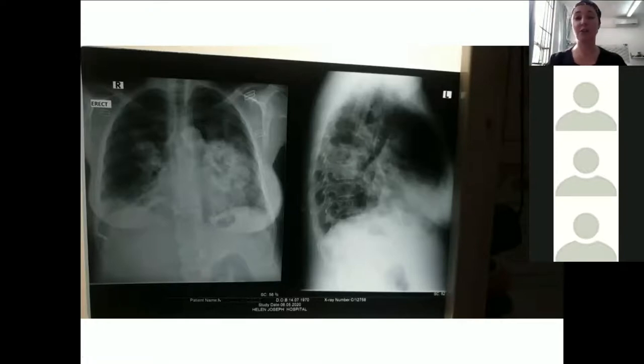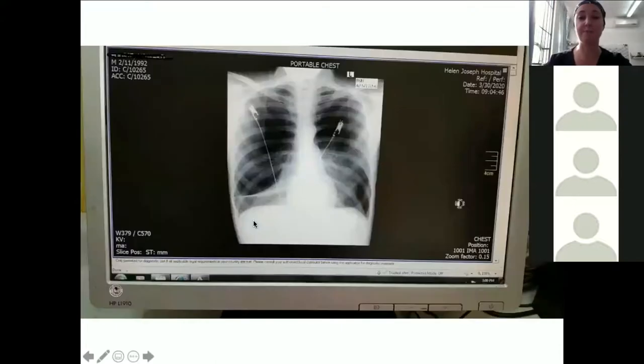Ideally, you want your patient, obviously, to be standing up, a proper PA view. You want them to have a gown on, not have a bra on, which makes me think that this was probably done as an AP and probably done in the emergency department for a sick patient sitting up in bed. Because often if we have sick patients, we tend to not get them up, we don't mobilize them, we don't undress them properly. We should, but often we don't. So I think that's probably what's going on with this patient.